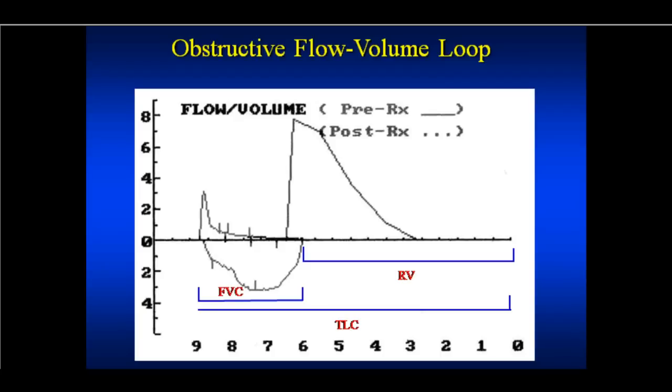This is the total maneuver here. This is the inspiratory loop coming back. RV is huge in this individual. All right, the airways are very floppy. When he does a forced maneuver, they just slam down at a very high volume, giving this very increased residual volume. This is obviously a very extreme case of severe airflow limitation. And the total lung capacity, as I pointed out, is huge.